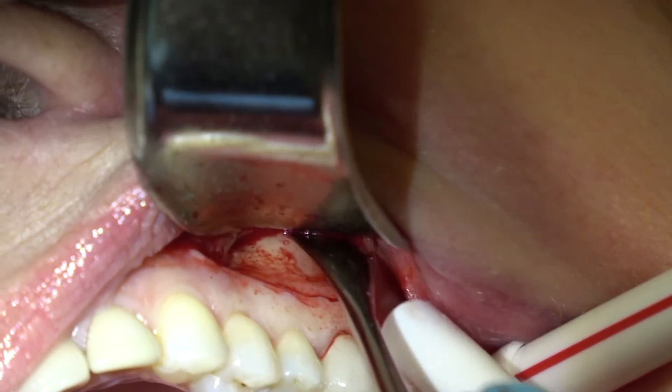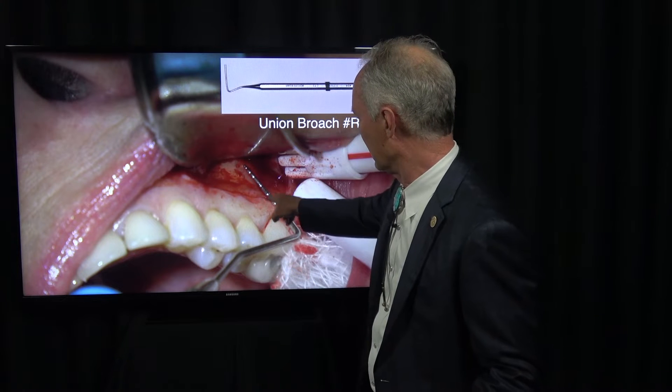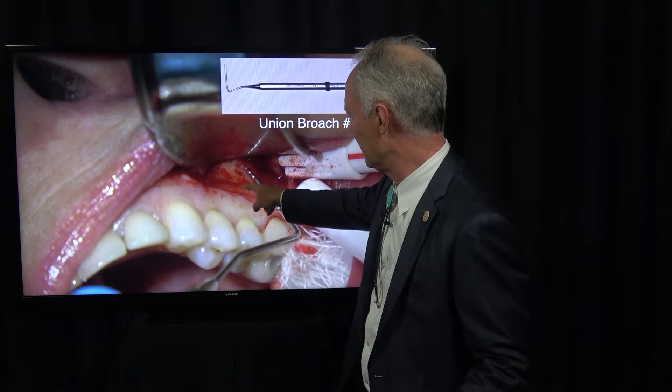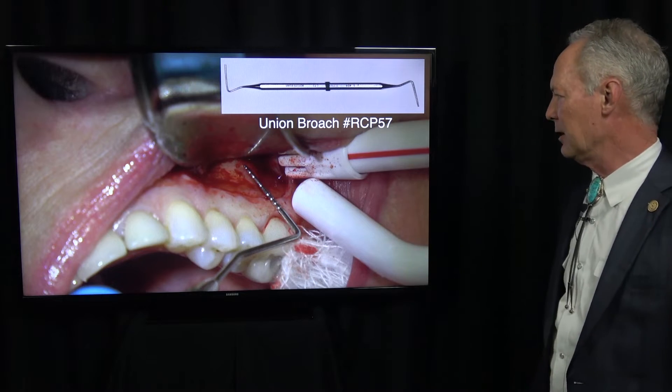This is a periosteal elevator, and now I'm measuring with my periodontal probe from the margin of the crown to the approximate location of the tip of this mesial buccal root — that's about 9.5 to 10 millimeters.